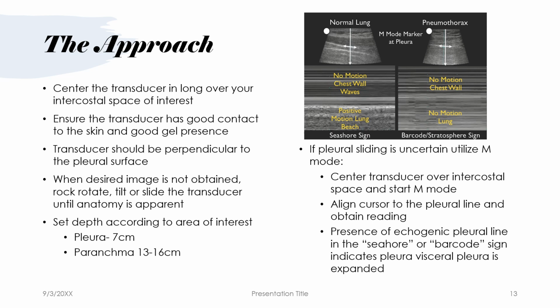You would set your transducer down in long. So that would be in long, with your transducer parallel to the patient's mid-sagittal plane in that apical area of the anterior lung. And you would look for the rib interfaces, or interspaces, excuse me. So here would be a couple of ribs, and you'd want to scan down through there, and then you're going to want to look for that pleural lining. Now, if you're getting difficulty picking up information from across the whole transducer face, it might be that you don't have enough gel, so always adding a little bit of extra gel or making sure that you have good contact across the whole area is going to be essential.